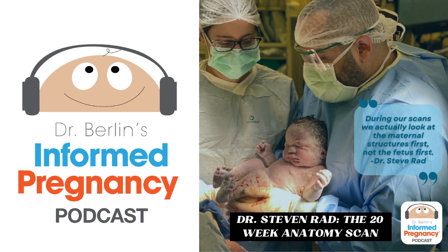Then we move on to the abdomen and we measure the size. By the way, the head, we measure the size of the head. I didn't mention that. Arms, we measure the bones in the arms. And as we go down to the abdomen, we measure the fetal abdominal circumference, which I think we've done a podcast on fetal growth restriction together. But so we measure the size of the fetal abdomen. In the abdomen, there's organs. The main organs we look at are the stomach, liver, gallbladder. Make sure there's 2 kidneys. We look for the bladder. Make sure there's no dilated intestines or any abnormal masses, or nothing's enlarged or blocked from these organs.